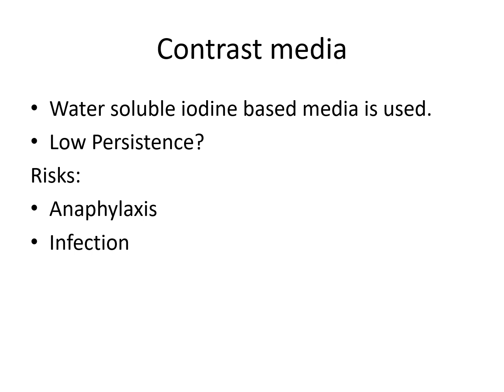Low persistence, well, what does that mean? Well, low persistence means that we want a contrast that, once we place it in the biliary ducts, we kind of want it to stay in the biliary ducts. Now, if the patient's sphincter of Oddi is relaxed and they're draining into the small bowel, we can't really help that.